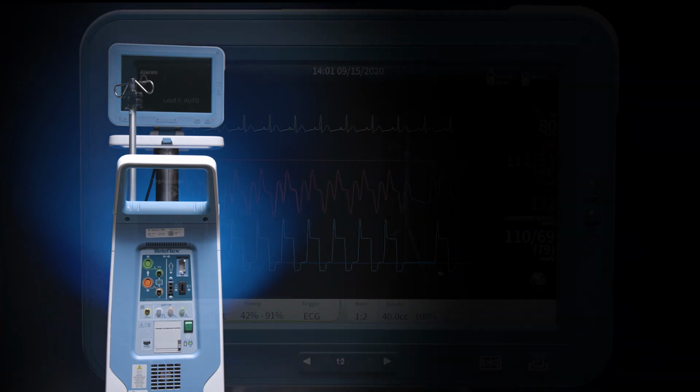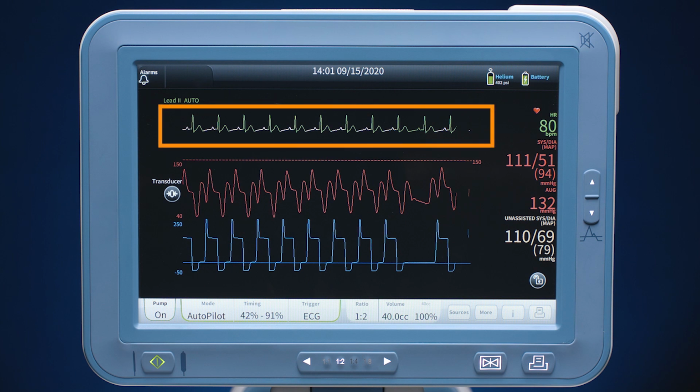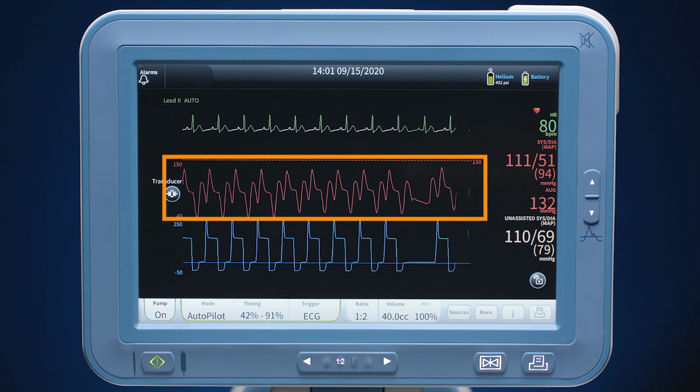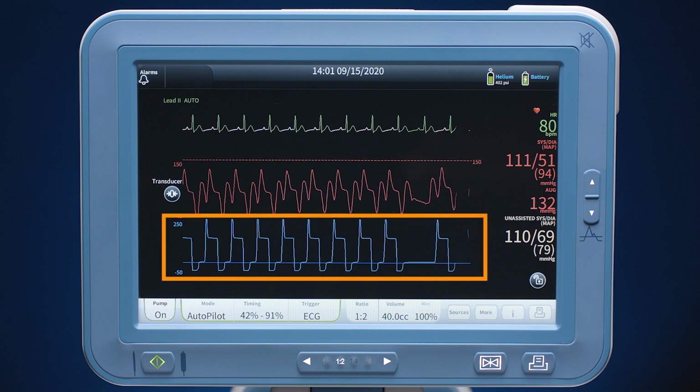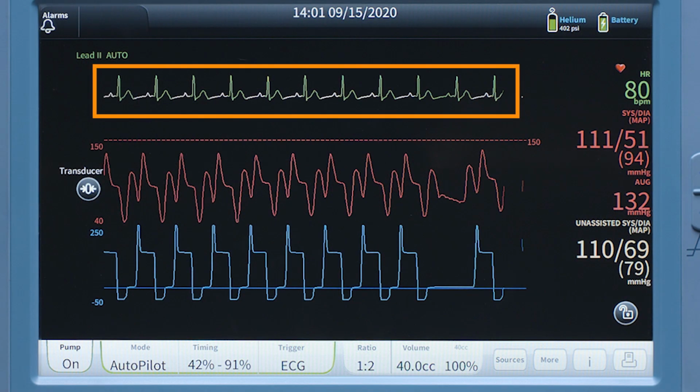The AC3 Optimus IABP display shows 3 waveforms and related data, each in a different color for easy identification and interpretation. All numeric data is calculated and displayed on a beat-to-beat basis. Heart rate is averaged over 2 seconds. The ECG trace is superimposed with white during assist intervals or expected period of IAB inflation.